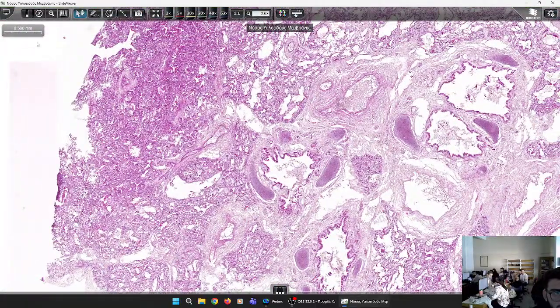So this is another case that might lead to restrictive lung disease due to fibrosis. So if you see fibrosis in the lung, you may think of all these causes: organization and complication of pneumonia, complication of left heart failure and congestion in the pulmonary microcirculation with hemosiderin deposition in macrophages and fibrosis.